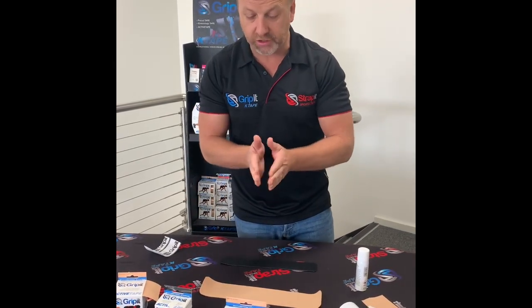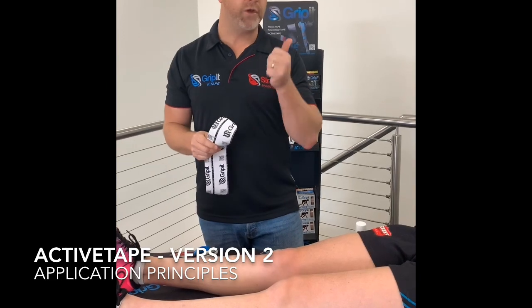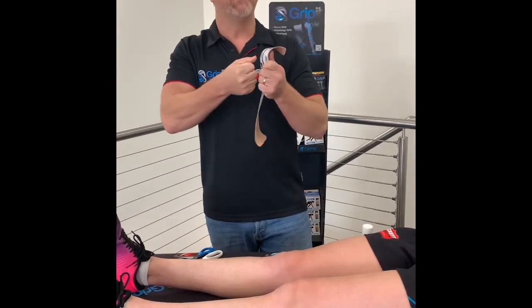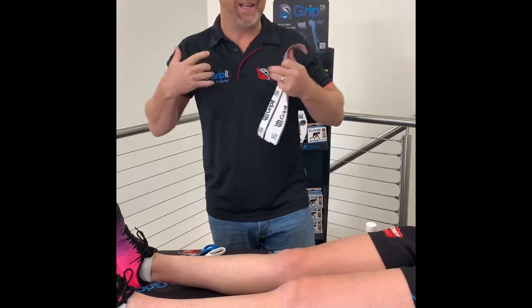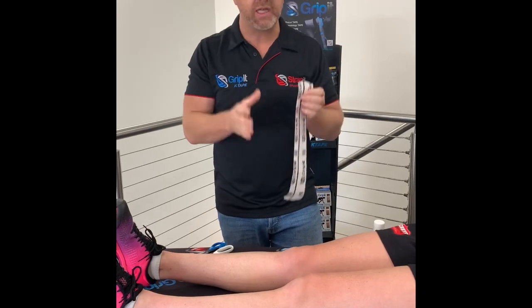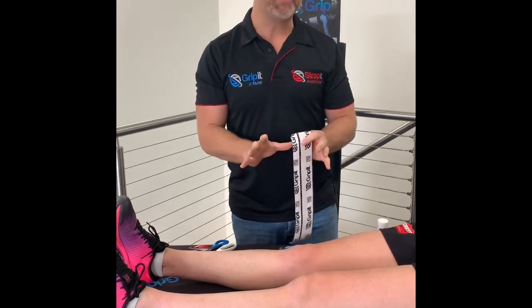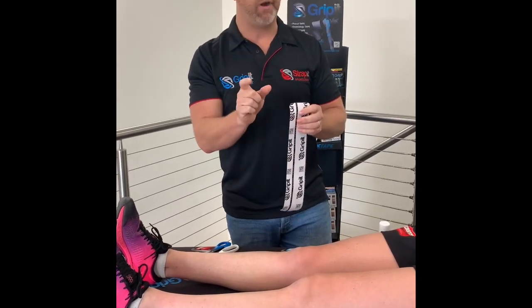The next thing we'll do, we'll actually go through the application method. Now we're on to the application principles of the tape. The version 2 is different to version 1, and also to others on the market, where when you pull the tape it loses form, which means that the more it's on the body, the more it relaxes. That's important for us because due to this having a memory, there's a bit more tension on the skin consistently, which is important in terms of how we apply it so that the skin's protected and the tape gives us bang for buck in terms of getting the best outcome for our patient.